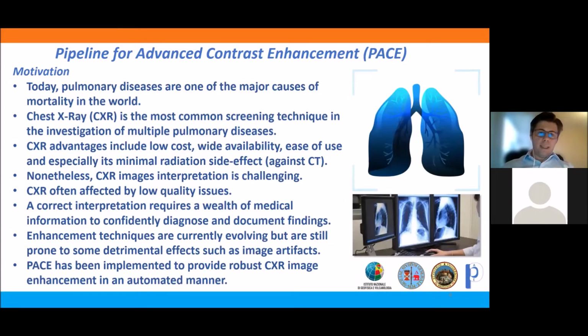Today, pulmonary diseases are one of the major causes of mortality in the world, and chest X-ray, or CXR for short, is the most common screening technique in the investigation of multiple pulmonary diseases. CXR advantages include low cost, wide availability, ease of use, and especially its minimal radiation side effect, if compared against a CT scan, for example. Nonetheless, CXR image interpretation is challenging.